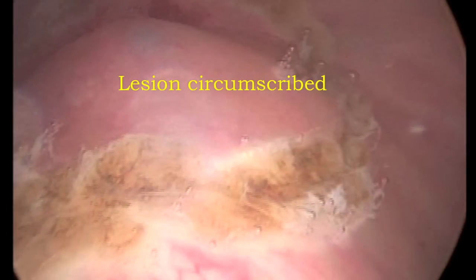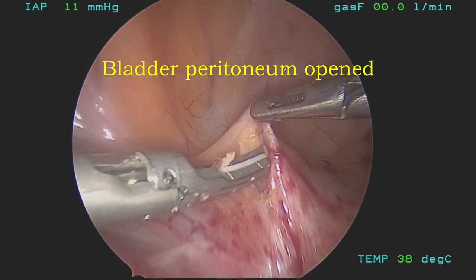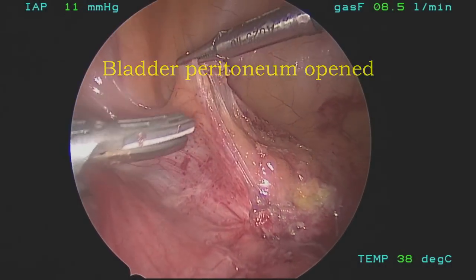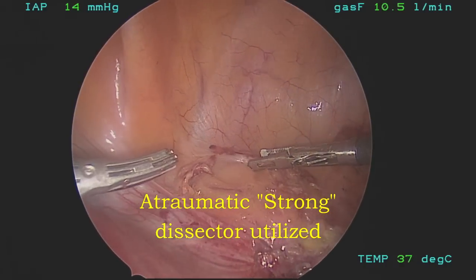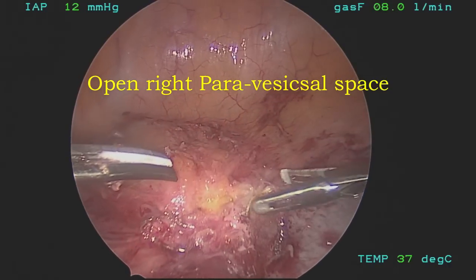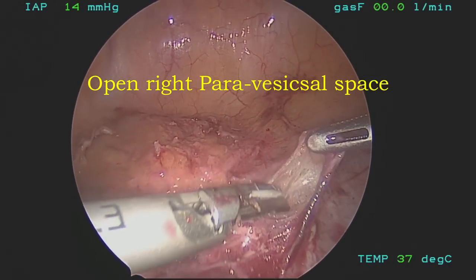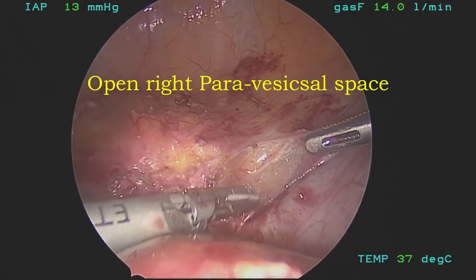Once the lesion is marked, the surgery from above can now begin. First of all, we will open the bladder peritoneum completely and then expose the dome of the bladder and start working along the sides. Now we open the right paravesical space. This is a clear area and can usually be easily dissected.